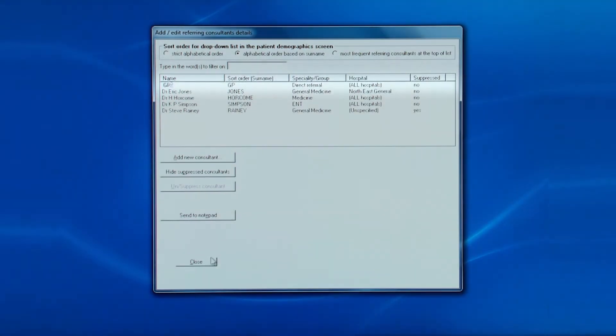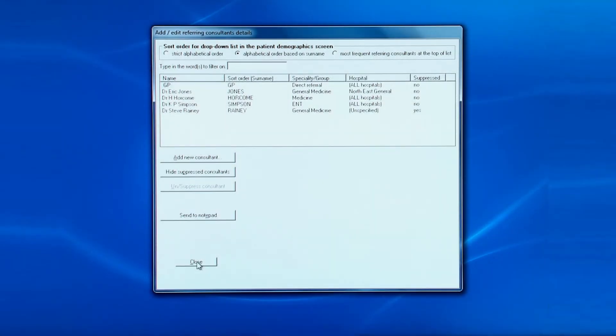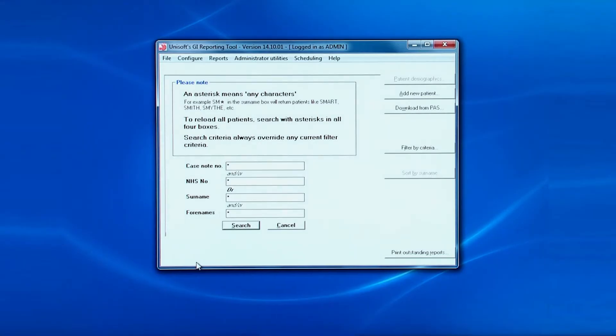Now that we've finished, we'll close down this window and move on to the next item in the administrator utilities menu.